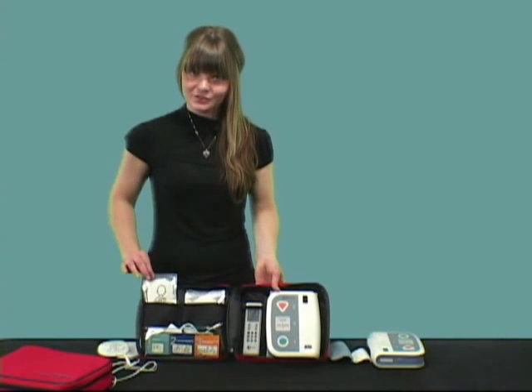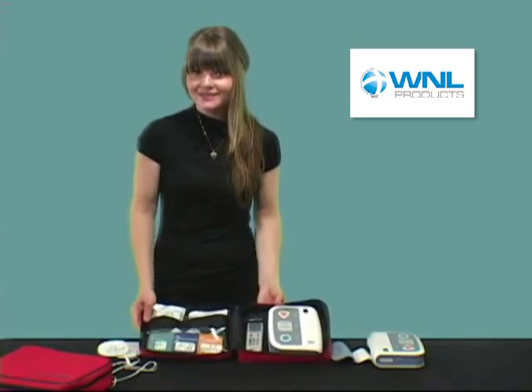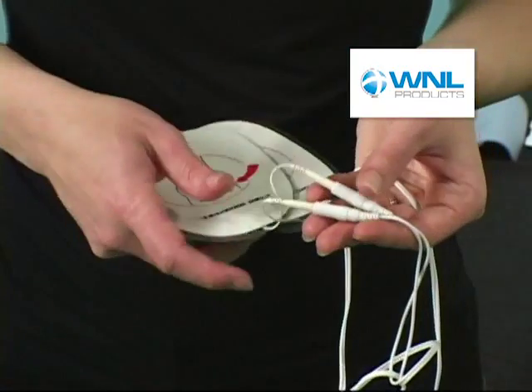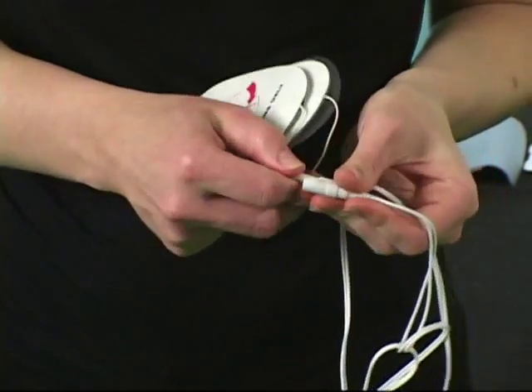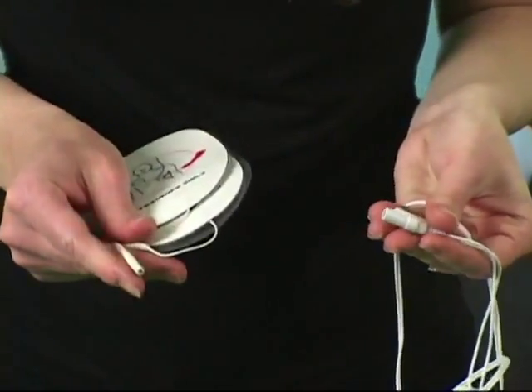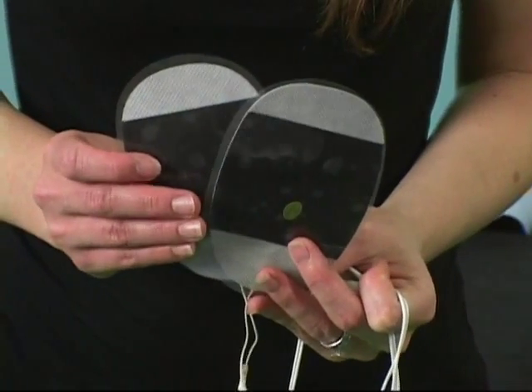Both the pediatric and adult training electrodes come with a cable that connects their electrode pads. When it comes time to replace worn out electrodes, you only need to replace the electrodes themselves and not the entire cable. The adhesive on these pads works well with almost all training mannequins.